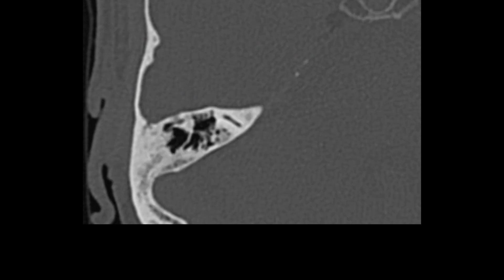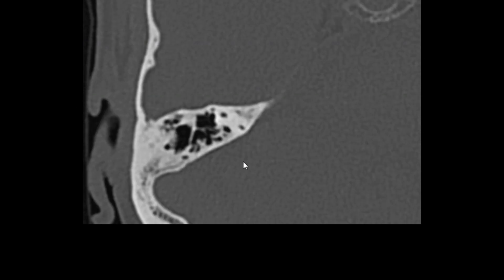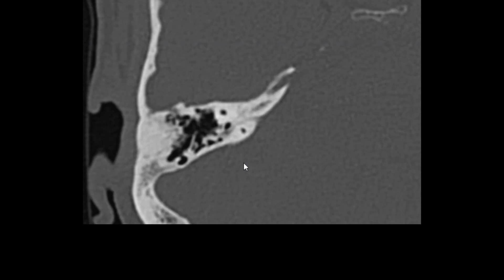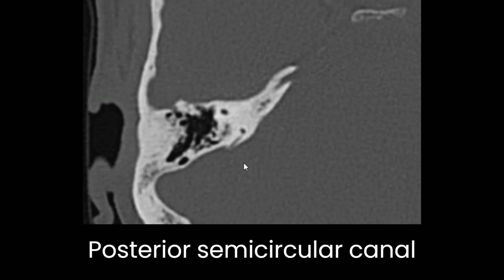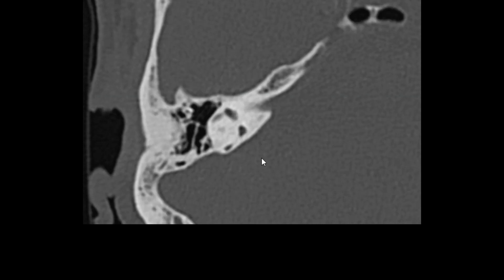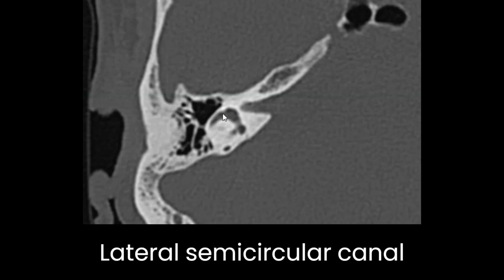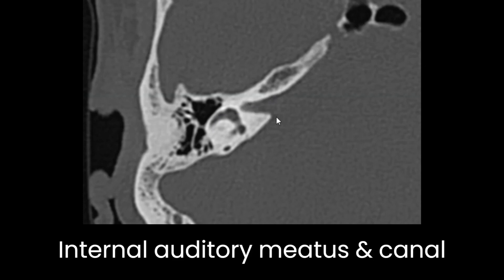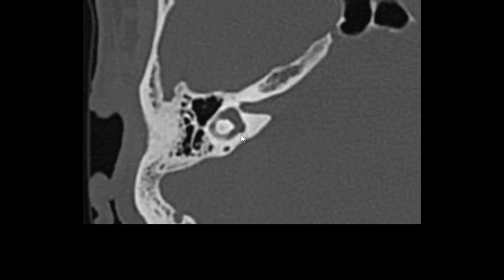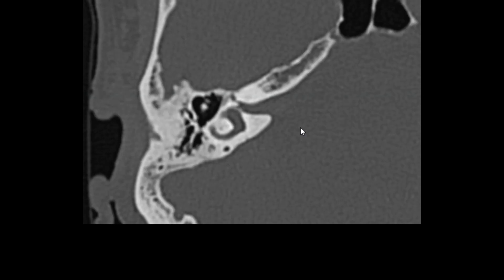Scrolling through axial HRCT for inner ear structures: the superiormost portion seen is the superior semicircular canal appearing as two dots — anterior and posterior portions. As we move down, we can start seeing the posterior semicircular canal. In lower sections, the bulbous vestibule appears where all semicircular canals attach, and we can see the lateral semicircular canal. In a good section, we can see the internal auditory meatus and internal auditory canal through which the nerves travel, and the lateral semicircular canal in continuity connecting to the vestibule.